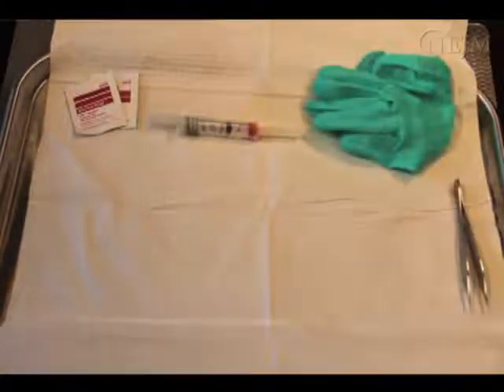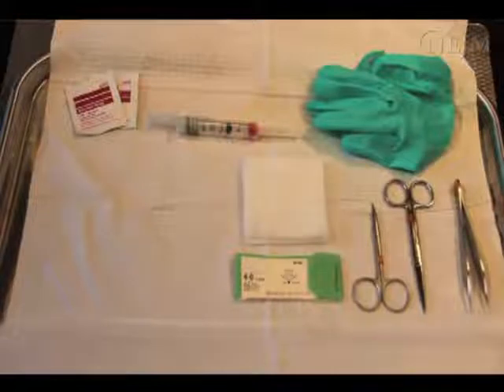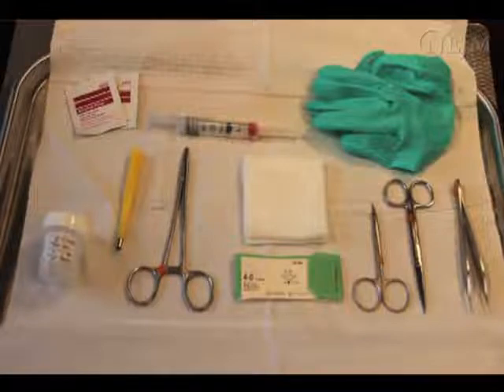Set up a standing tray with a clean disposable cover and place all necessary materials on the tray. While exercising clean technique is important, it is not necessary to maintain a sterile field. You will need alcohol pads, a local anesthetic, gloves, tooth forceps, scissors, suture material, gauze, a needle driver, the punch instrument itself, and a specimen bottle that contains formalin.